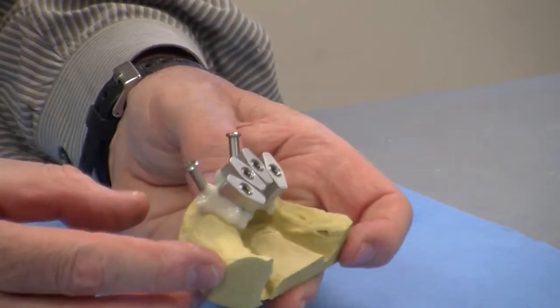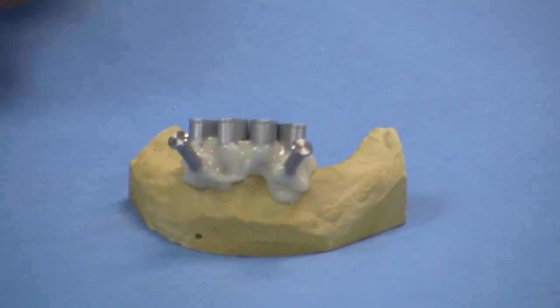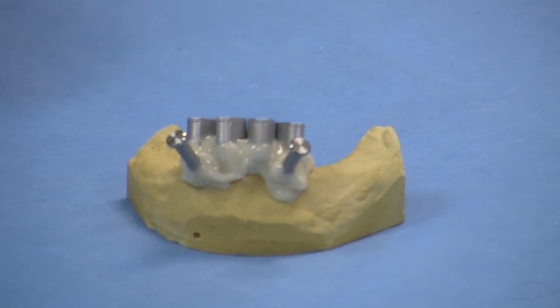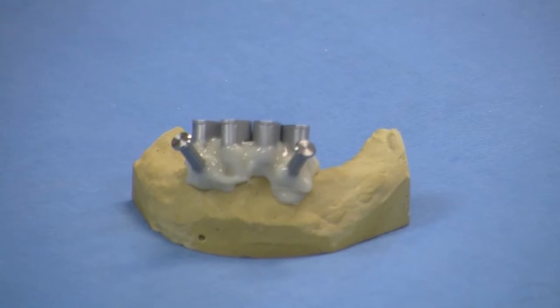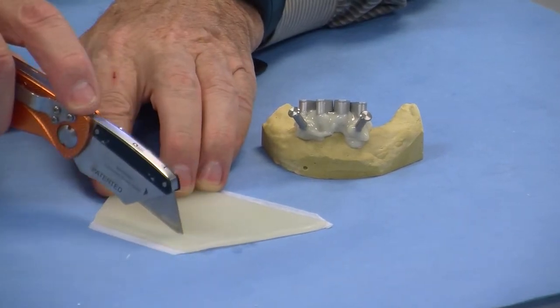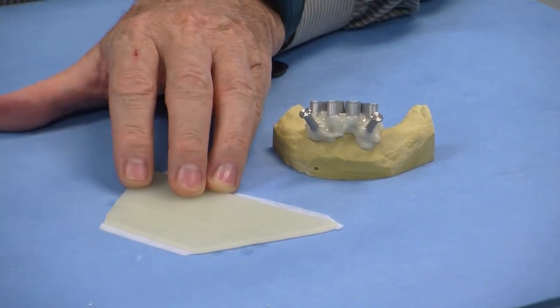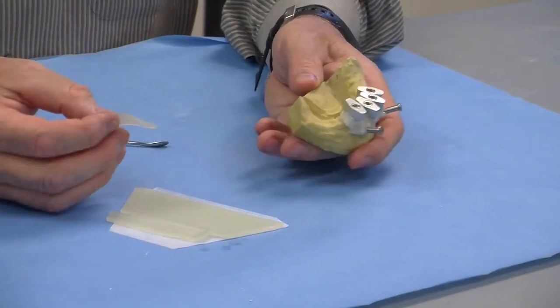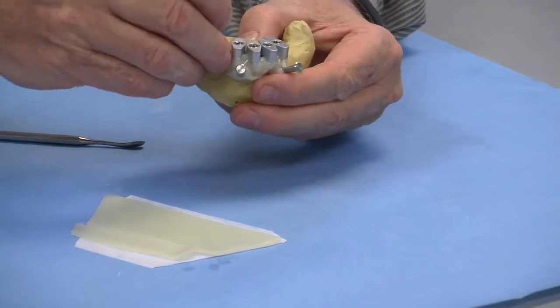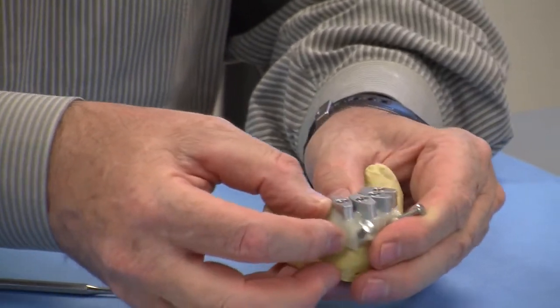And now we can wait until it sets. The second layer of the surgical frame holding the guide will be done with Triad material used for custom trays. Some layers, some bands of Triad are prepared. So the Triad is placed using a simple technique of hand molding.